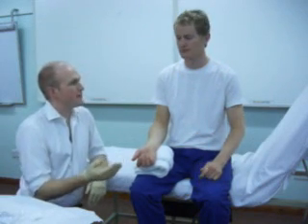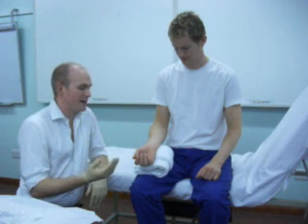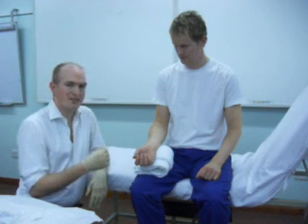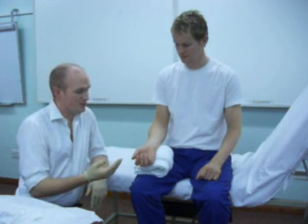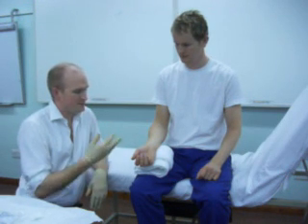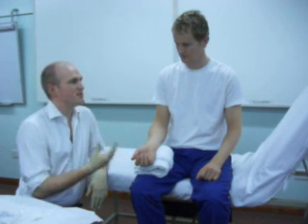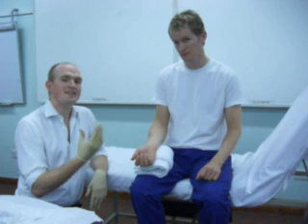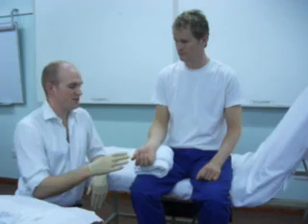For this next shot we're going to demonstrate an arterial blood gas as you would do in an exam. There are some dummies which can simulate this sort of procedure. To do an arterial blood gas you obviously need the patient's consent, and one of the things you need to do is to check that the patient's got adequate blood supply in the hand before we think about doing the procedure.